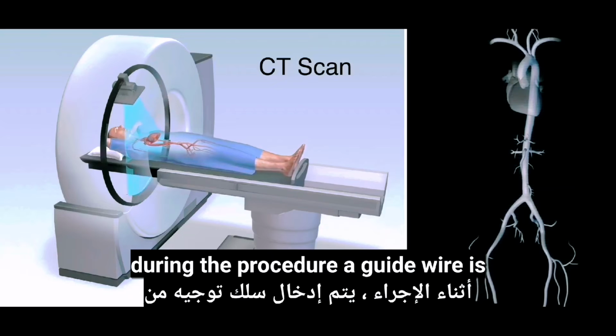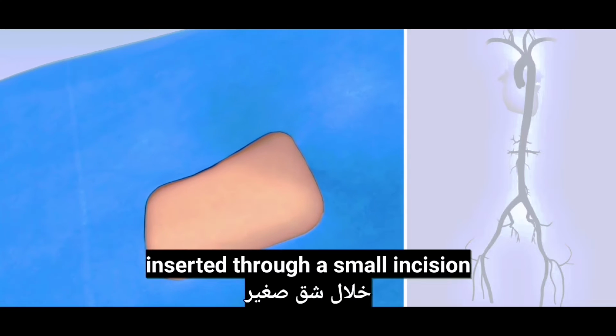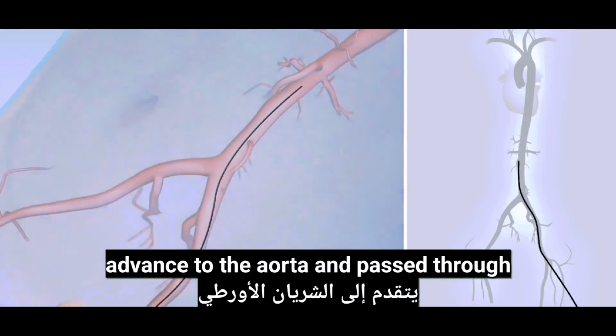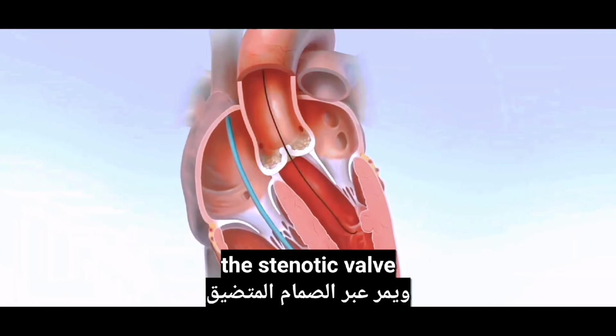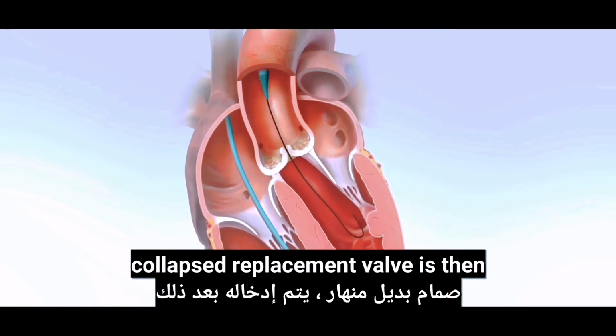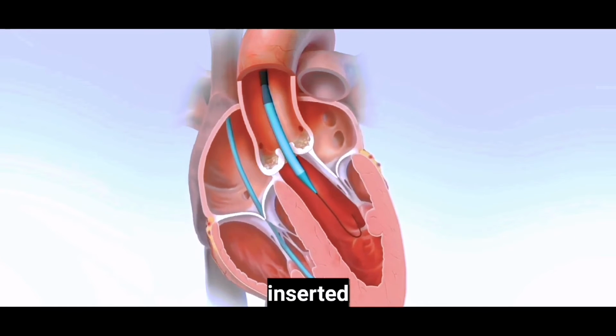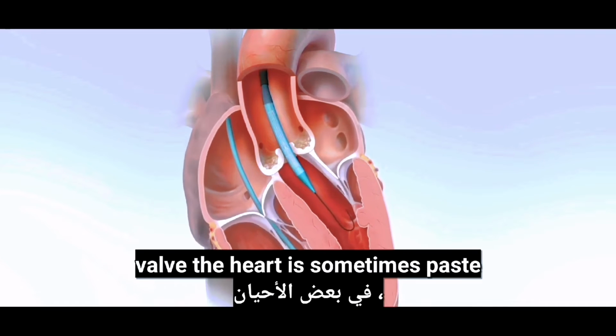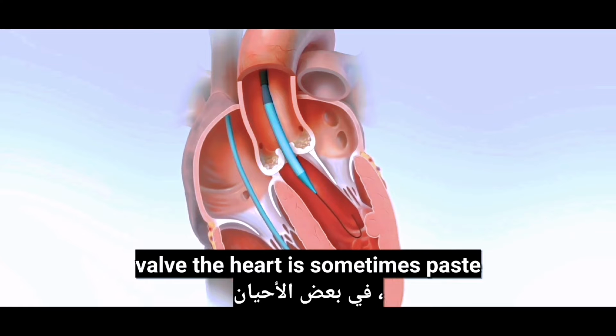During the procedure, a guide wire is inserted through a small incision, usually into an artery of the leg, advanced to the aorta, and passed through the stenotic valve. A special catheter that contains a collapsed replacement valve is then inserted. Once the physician has the new valve positioned correctly within the diseased valve, the heart is sometimes paced.